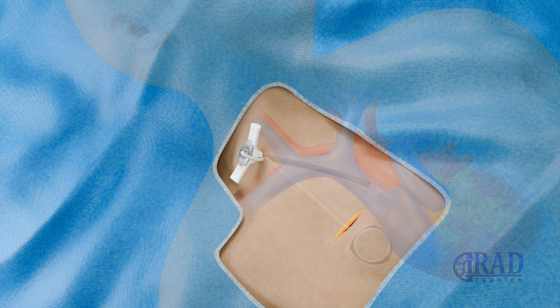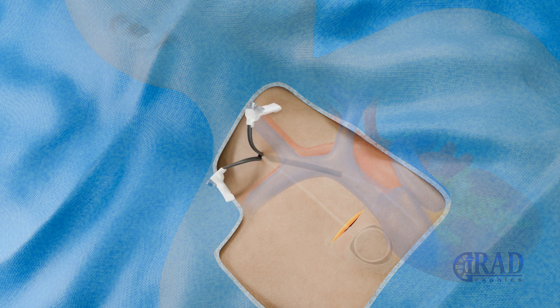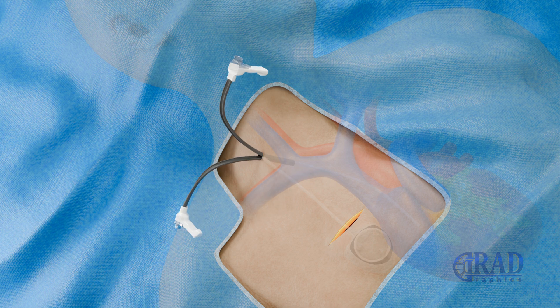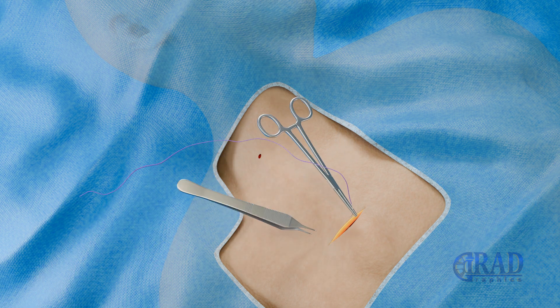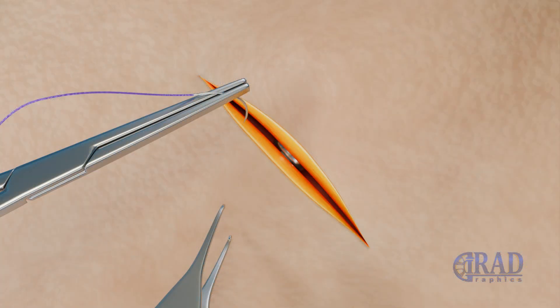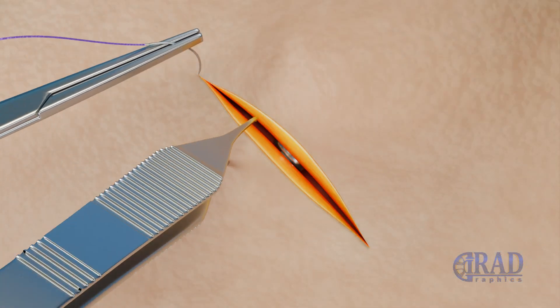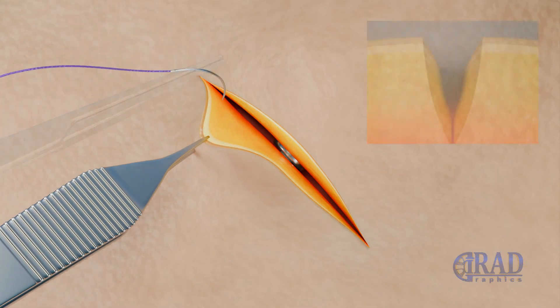Subsequently, the peel-away sheath is removed, and the catheter is fully secured beneath the skin at the venous access site. Ensuring that the catheter is properly aligned, the port pocket incision is closed using bioabsorbable sutures based on a simple buried suture technique.